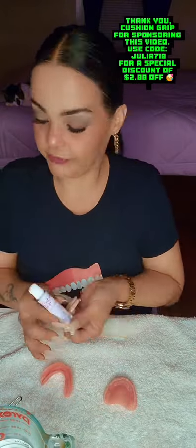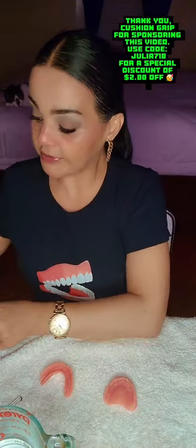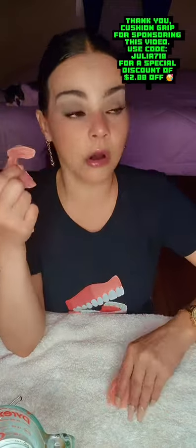You also want to make sure that when you're taking your Cushy Grip out of the water, these little caps can hold extra fluid inside. Make sure everything is super dry — no moisture on your hands, fingers, or anywhere around your denture before your Cushy Grip application.